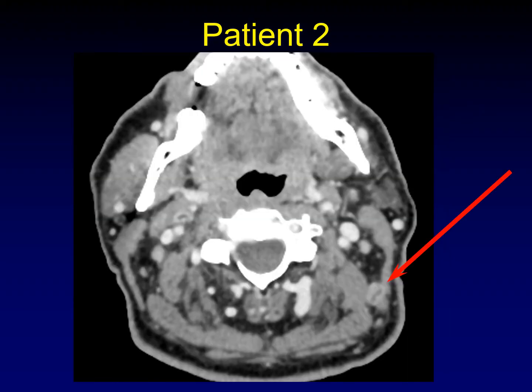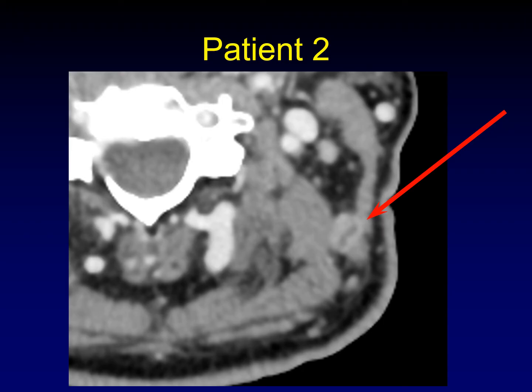Here's patient number two. I'm not going to test your eyes — I'm just going to point to the abnormality. And once again, I'll make it bigger so you can see it. There, another lymph node. Would you call this one metastatic disease?